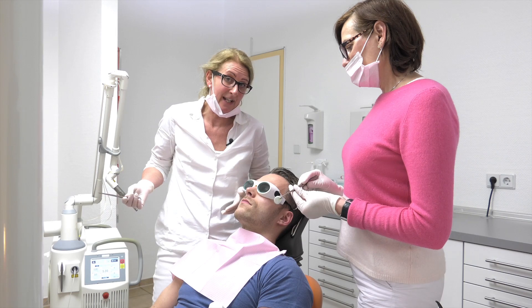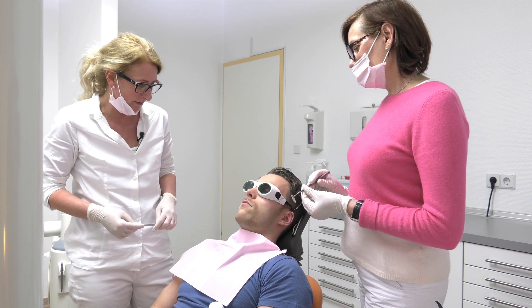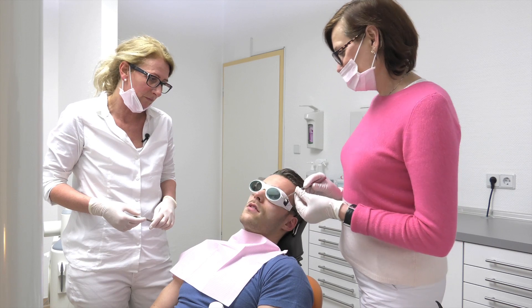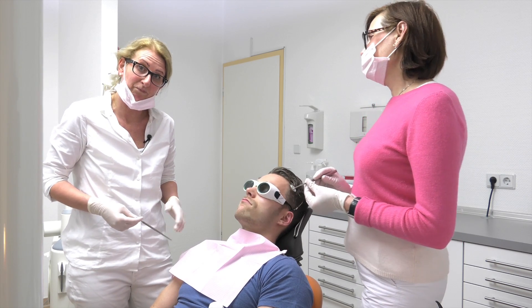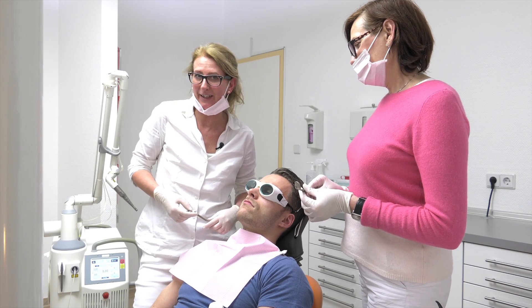Just let us ask the patient how he feels. Micha, how do you feel? The treatment was painless and very relaxed.